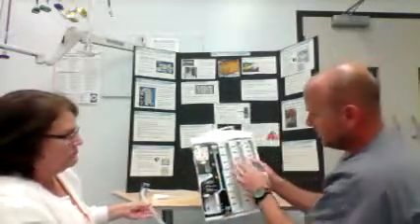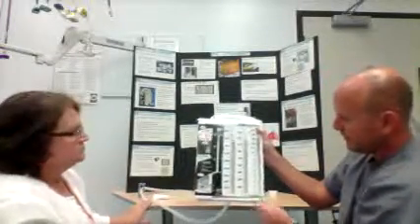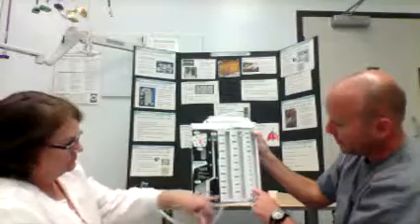Okay? This is the collection chamber for any fluid that drains from the pleural cavity, and you see it's graduated. So if the patient has a chest tube for days or weeks, you may be doing output measurements, Q4 or Q shift, depending on what the doctor's order is. And there's room to mark with a Sharpie the date and time, and it's just a running log.